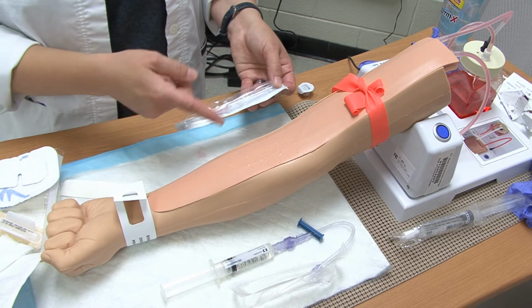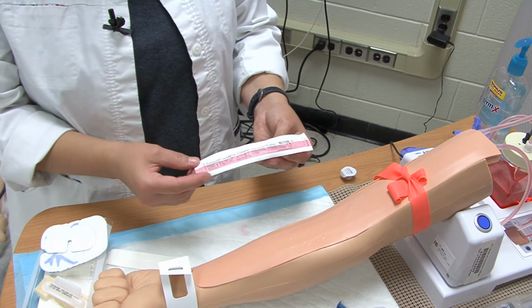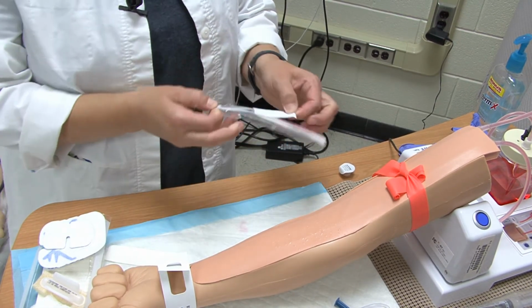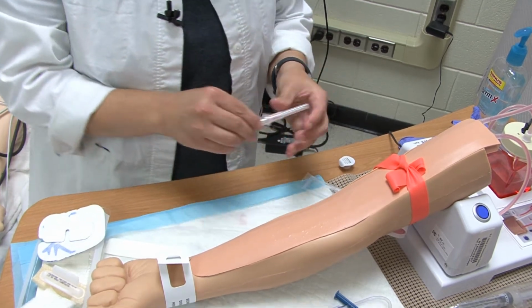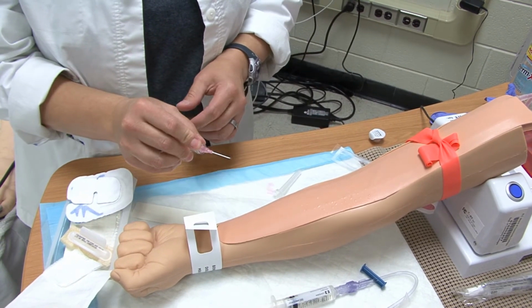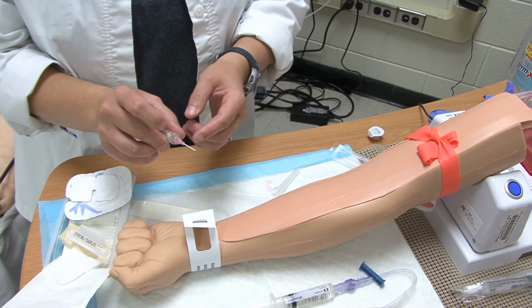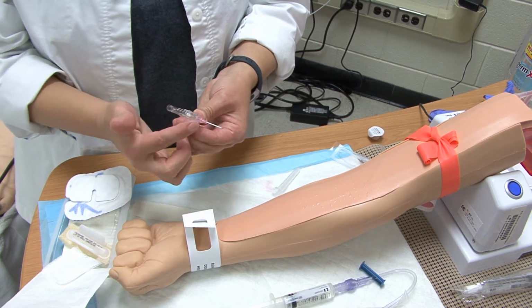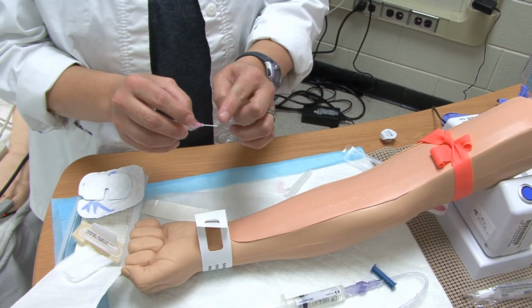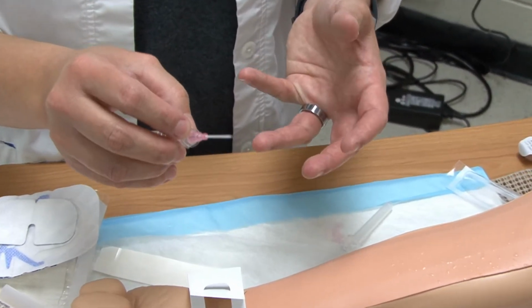Now, I have determined, based on the patient's vein, that I'm going to use a 20 gauge because the vein is large enough in diameter, and I do have a good 1.25 inch length of the vein. So as I'm doing this, I'm going to open it up, and I'm actually going to take the IV catheter out, and I'm going to go ahead and assess it. And I need to make sure that it is clean and dry and intact, and there are no spurs or burrs on it. I can actually touch this clear plastic piece, and I can touch the pink hub, but I cannot touch anything down through here. This needs to stay sterile. If it ends up getting touched, it's contaminated, you need to actually get a new IV.